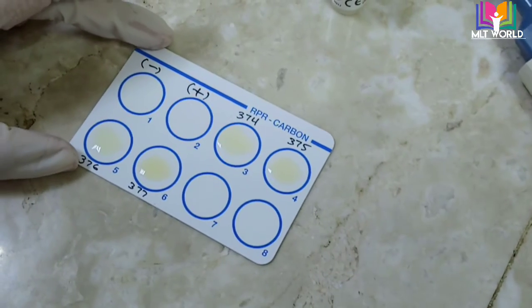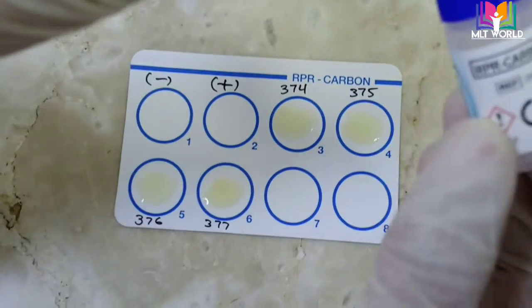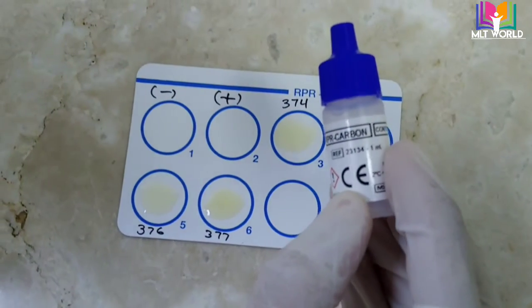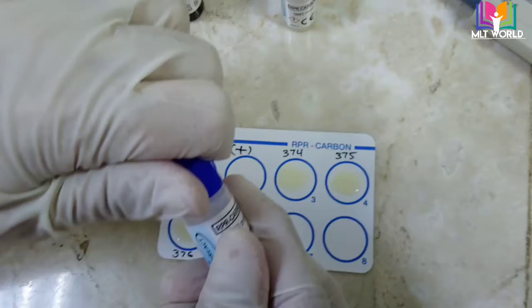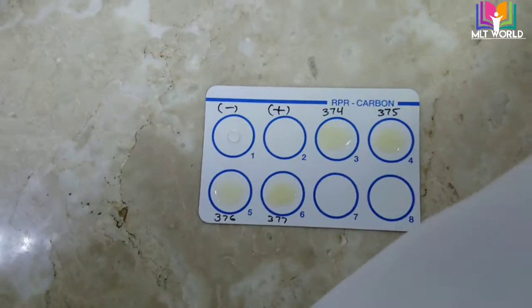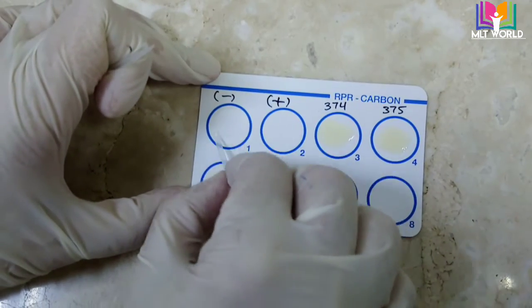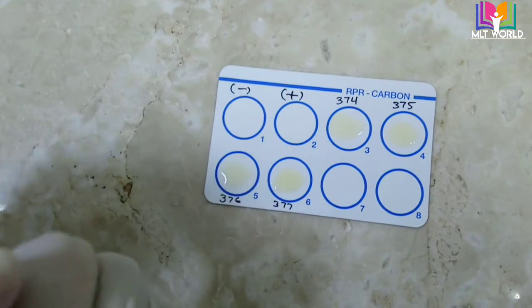We will spread the serum in each circle. We need 50 microliters of serum and 20 microliters of RPR carbon reagent. Before performing the test, make sure the reagent is mixed properly. The controls come in their bottles — we will take one drop of negative control and one drop of positive control. It is better to write the opening date on the reagent bottle, which helps you estimate how much reagent you use per month for future orders.